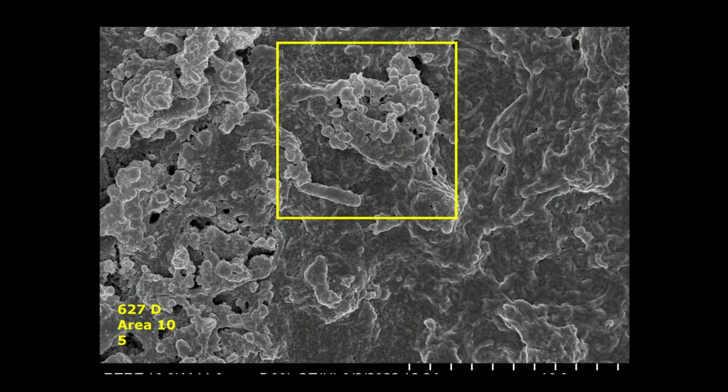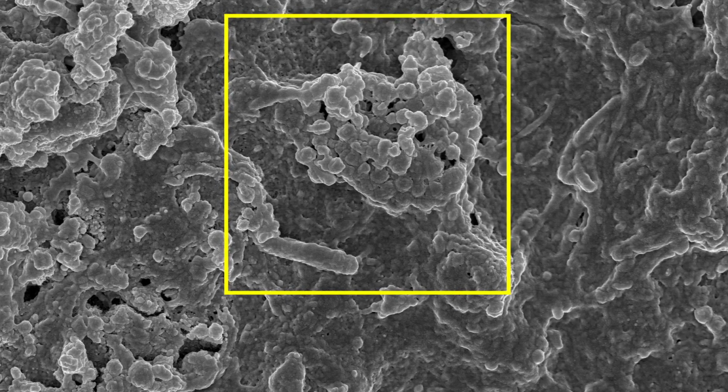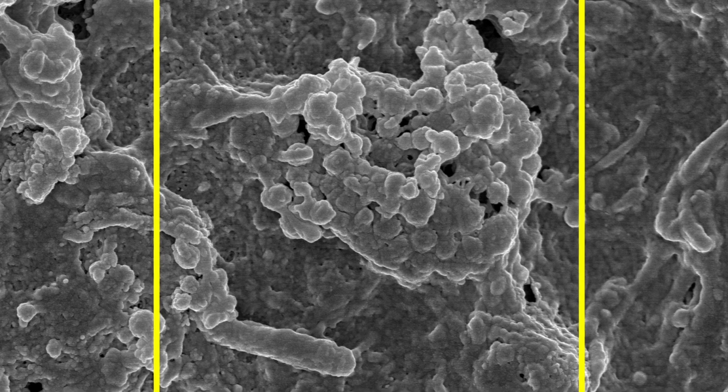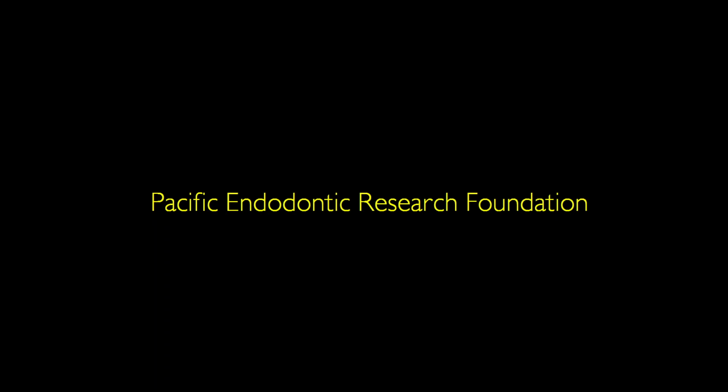Images like this just point out how difficult it is to make these determinations and how one must lower their confidence when making such inferences. I hope these examinations help you, and I am open to discussions if desired.